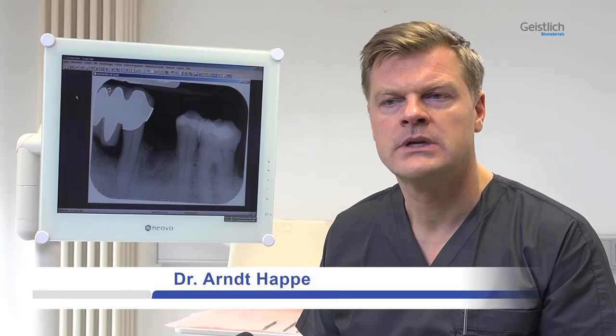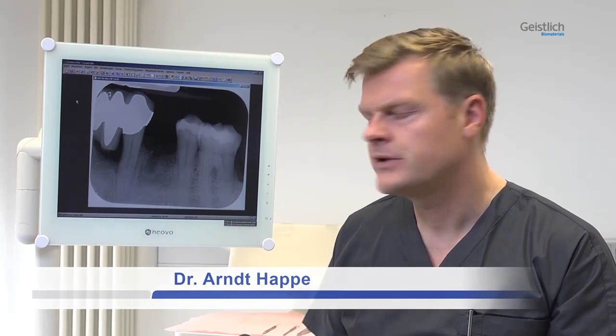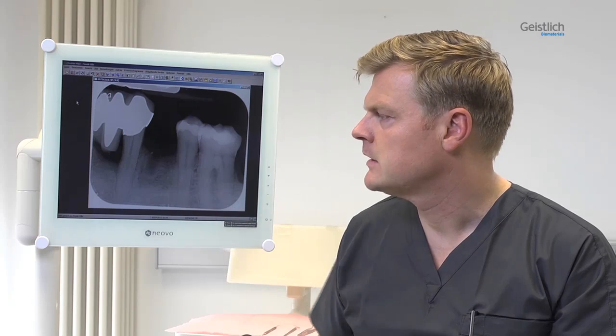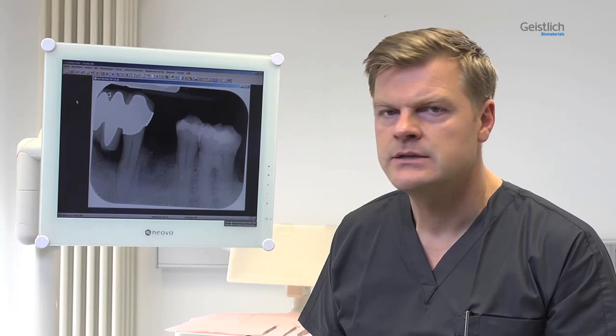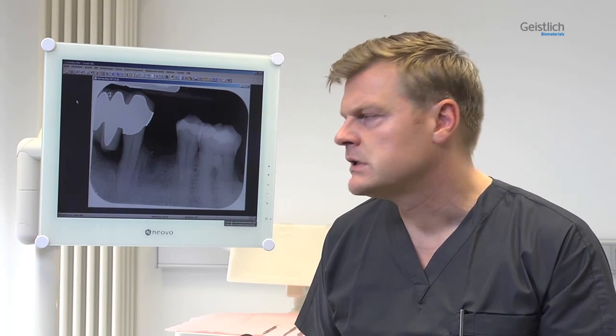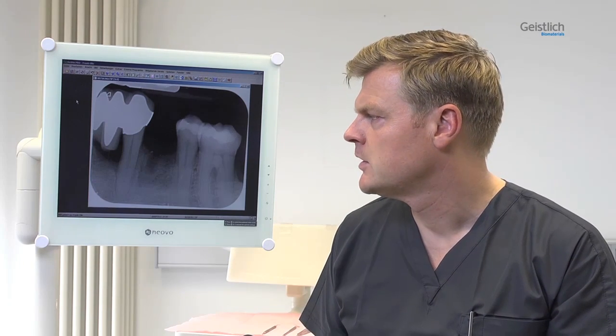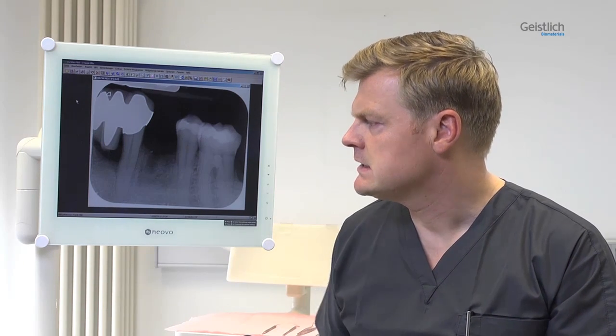The patient is a healthy 69-year-old man and a non-smoker. Two months before the present intervention, tooth 3-4, which had been endodontically treated in the past, needed to be extracted. In the course of this treatment, the apical tip of the tooth was resected. Site 3-4 therefore exhibited corresponding scars on the vestibular side. A moderate alveolar ridge defect is recognizable in the radiograph.